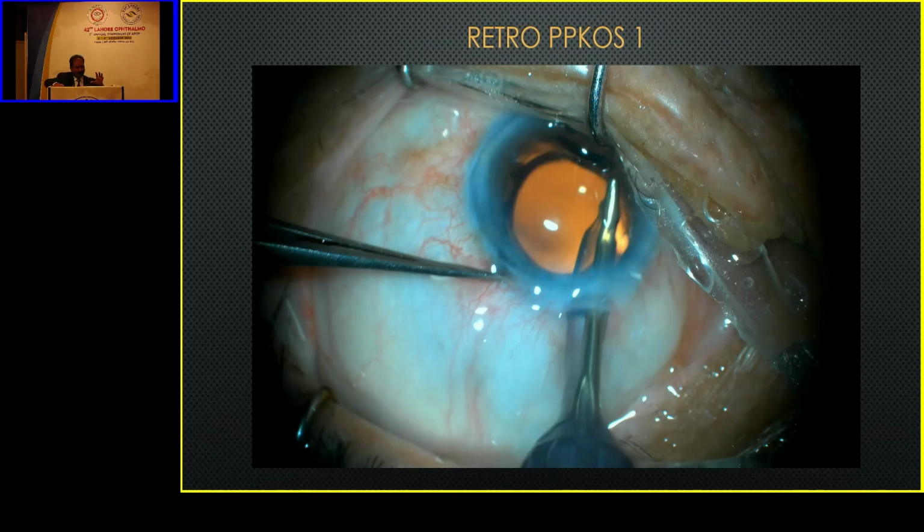Two other indications are a very small rhexis, because it will be difficult to enter underneath the margin of the pseudophakic lens, and a very large rhexis. If the rhexis is accidentally large, and you go behind this, the IOL will come out. And we don't need it actually in large rhexis. Just press the lens downwards, and all the viscoelastic will come out, and you can take it out from the anterior surface of the lens.